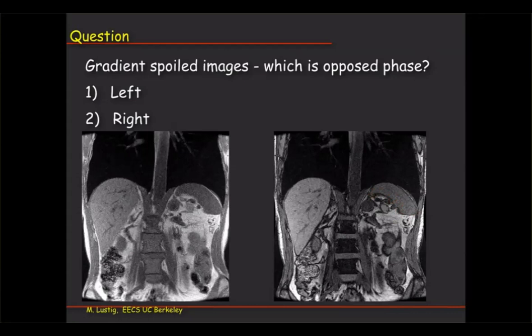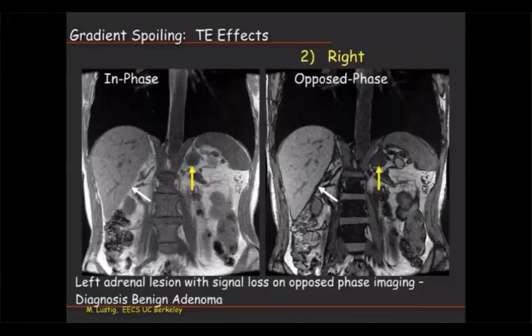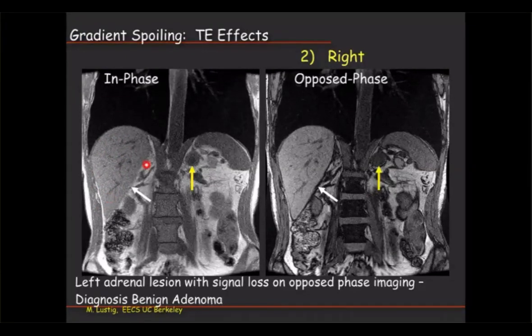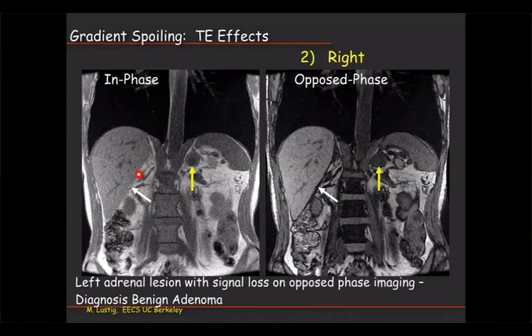Here you see all the contouring, and so that's very nice. If you actually look at those arrows, you see this is the liver. The liver, although it has fat, the amount of fat in the liver is about 5% for normals. So it's not a huge amount. So around it, this is more visceral fat, I think it's called.